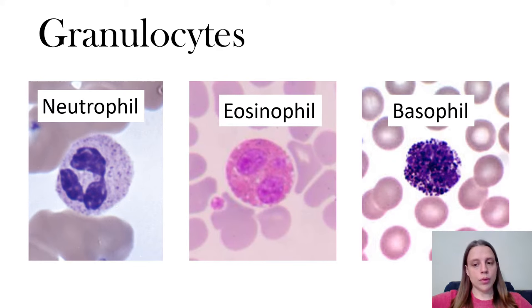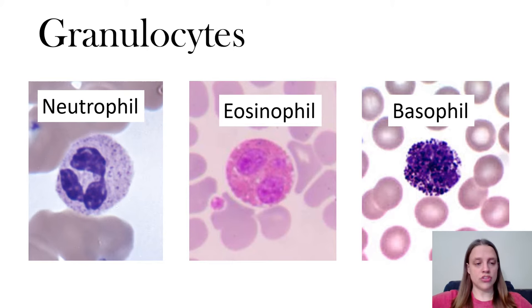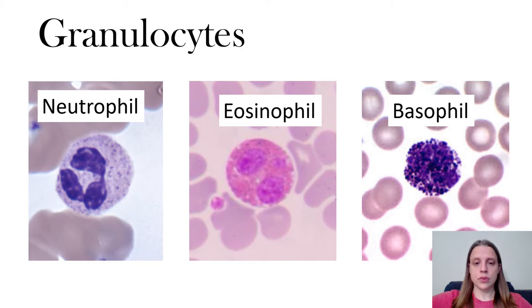Sometimes if the slides are very faded from being under the light for too long, you'll have a hard time deciding if it's red or not. In that case you want to look at the nucleus. In the neutrophil you can see there are three irregularly shaped balls that form the nucleus — neutrophils usually have a multi-lobed, kind of crazy nucleus.